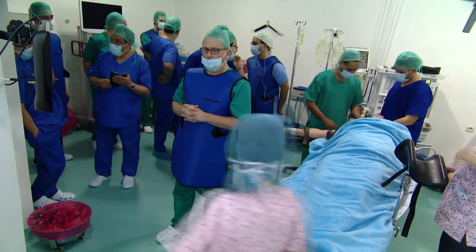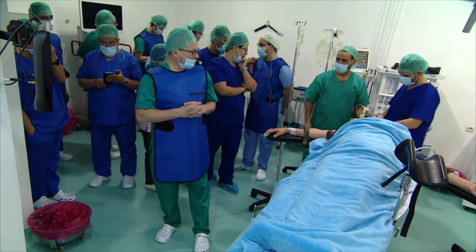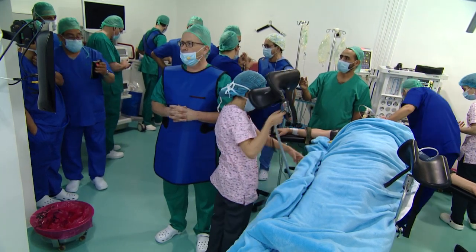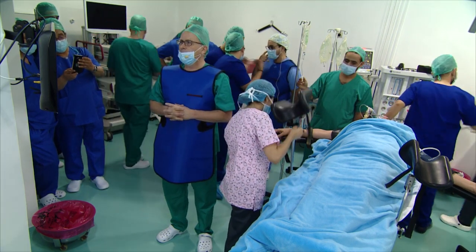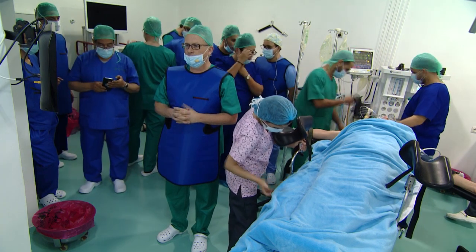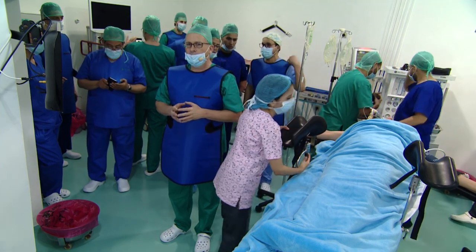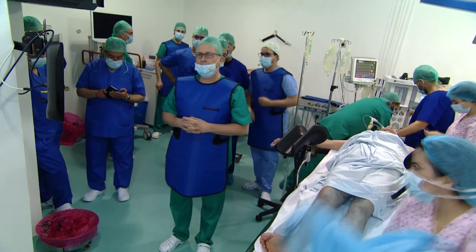Okay, let's have a look. Yes. If we can start our procedure, the patient got general anesthesia. And the first part of our procedure will be to perform a retrograde pyelography. Later on, I'm going to show you that we have a special ureteral catheter available, which allows us to have a good approach to the ureter and to fix the ureteral catheter above the ureteral pelvic junction.